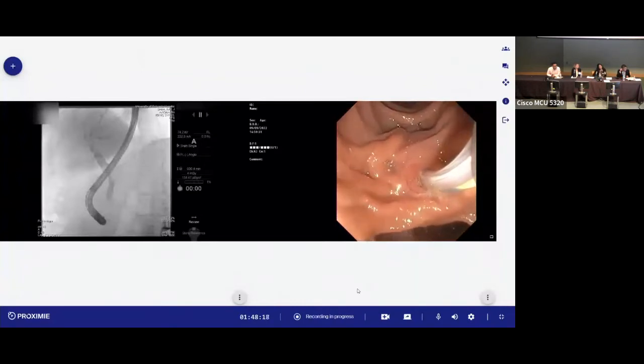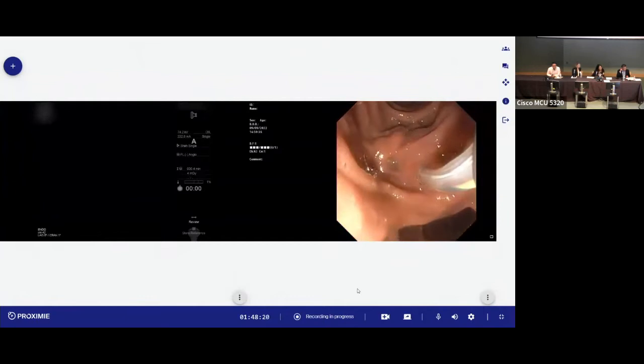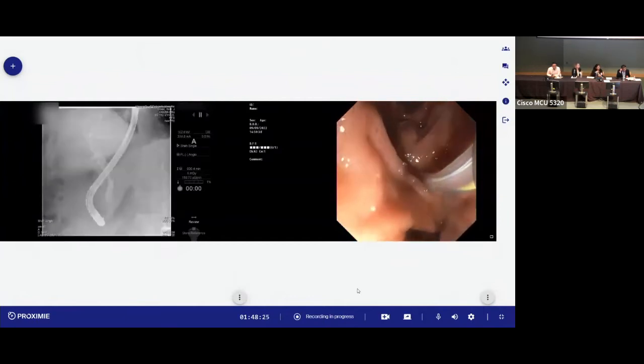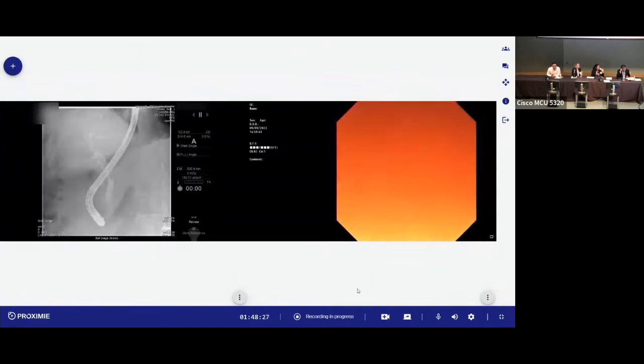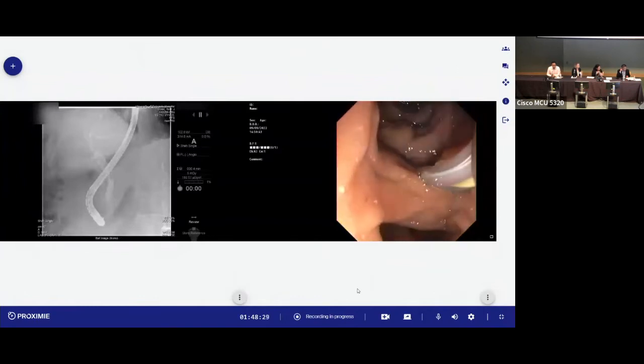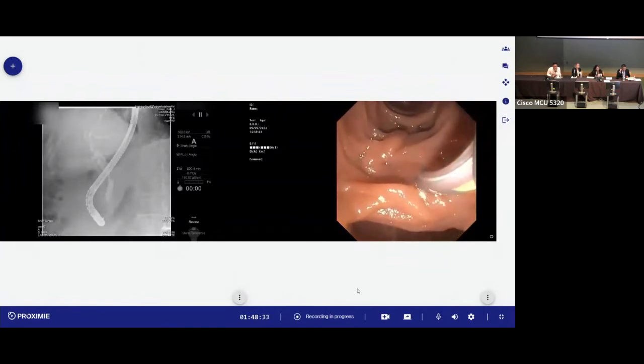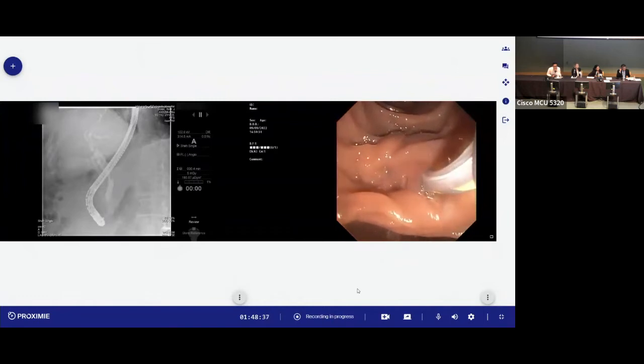The question that Jeff was asking me was related to, there we go. So we can send this image over to reference like this. Yeah. So the question is related to when are you more conscious about injection? Yeah, judicious use of contrast.